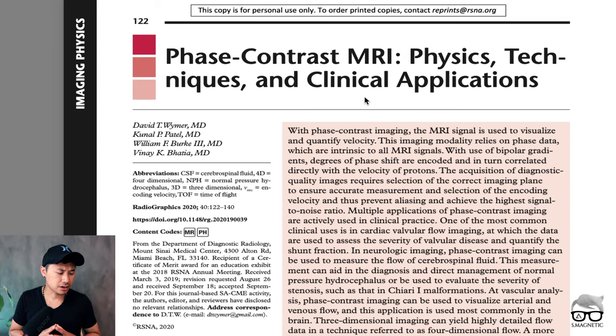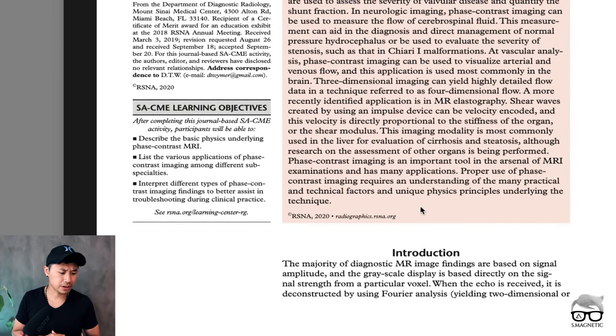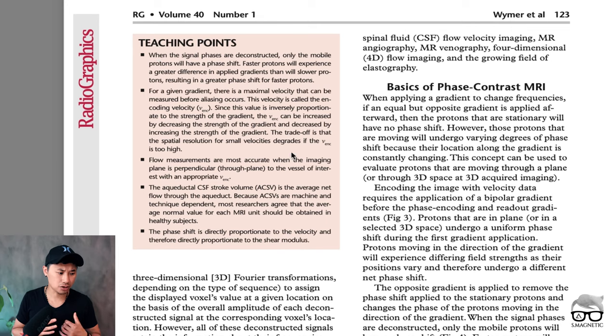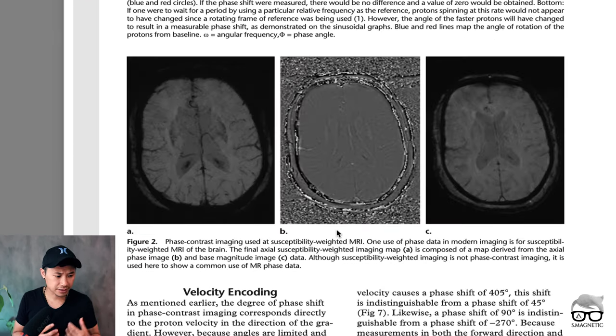This paper talks about phase contrast. We're using a phase contrast approach when it comes to flow quantification, so it's really good to have some background understanding regarding that. It will give you a nice introduction to the basics of phase contrast. It's an old approach, nevertheless it's gold and it's used every day. And here are nice figures.